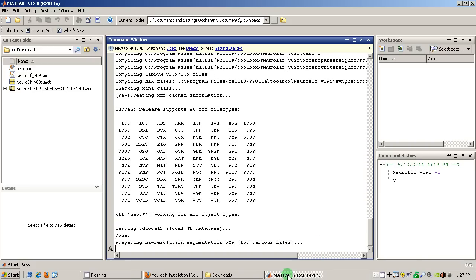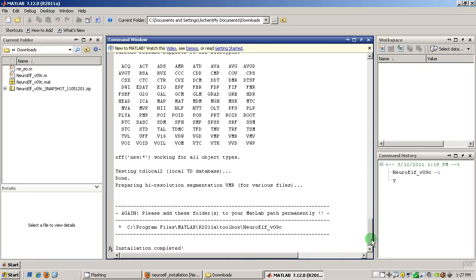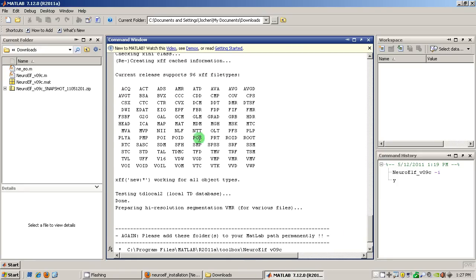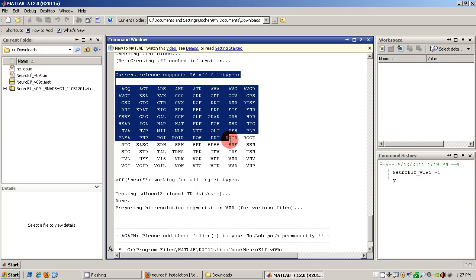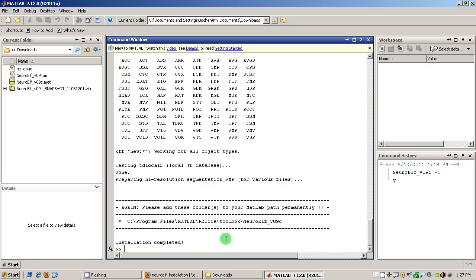Okay, so at the end this also creates some additional information in a cache that contains all the file formats that the toolbox supports and now the installation is complete. And you can then start NeuroElf's GUI by entering NeuroElf underscore GUI for graphical user interface.